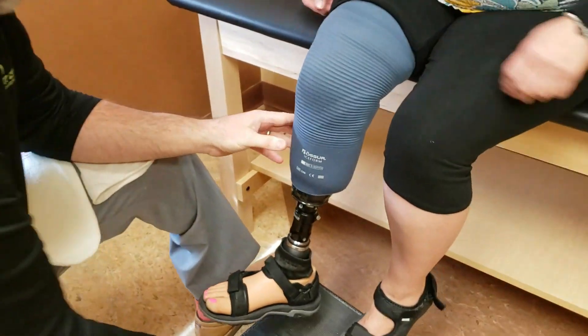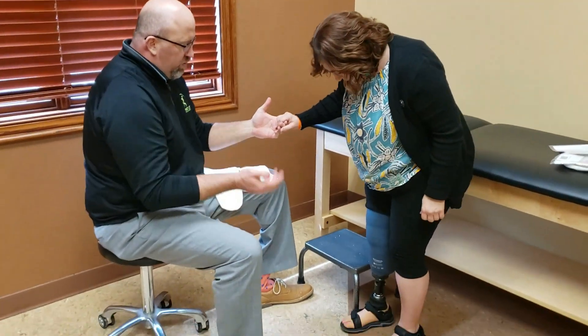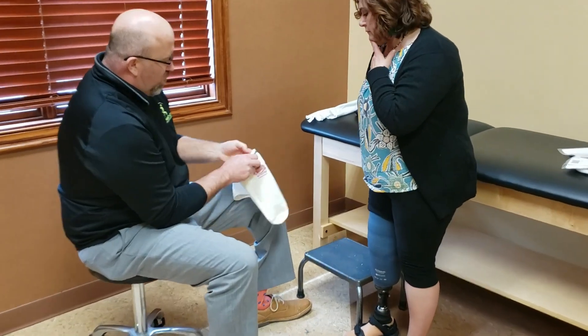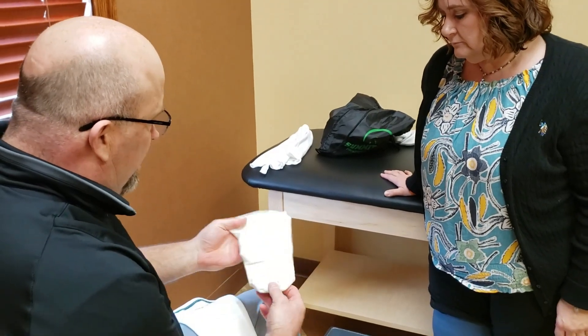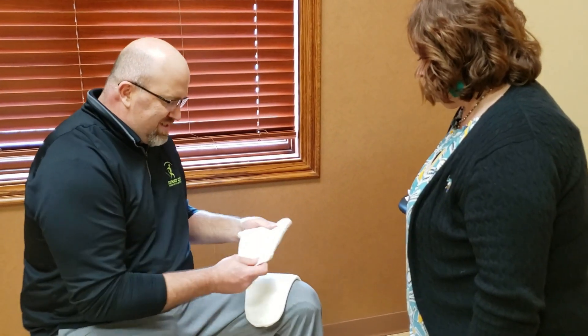Go ahead and bend the knee down and step off the table. We know when we put the prosthesis on there's air trapped in there — the more sock you wear, the more fibers trap air. When you're in a very thin ply count, there's not a lot of air trapped, so a few weight transfers back and forth will help purge the system of most of its air.